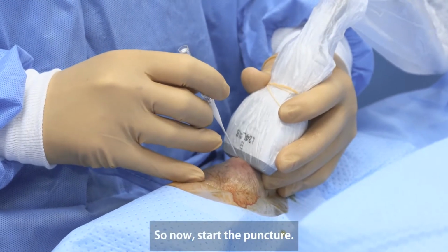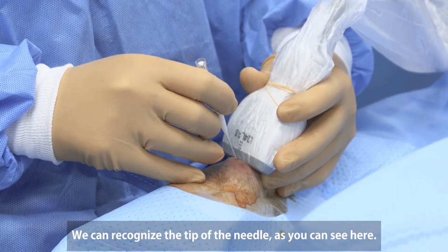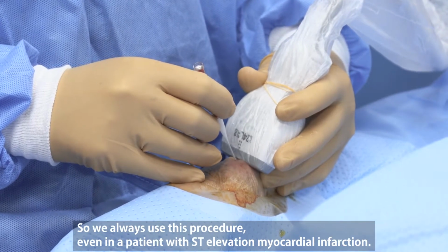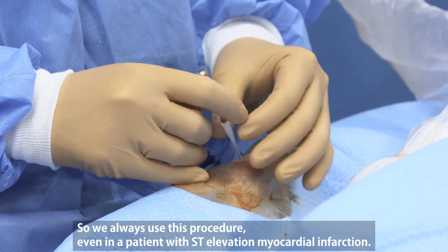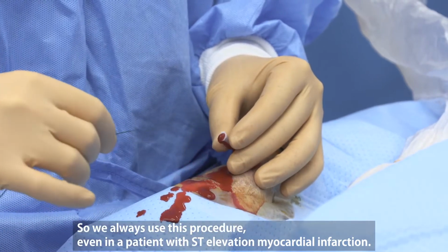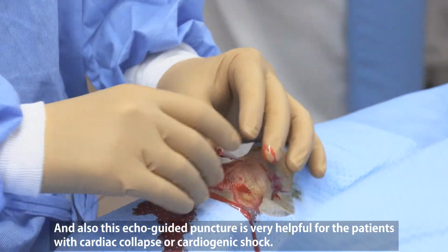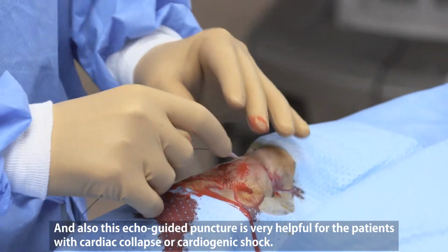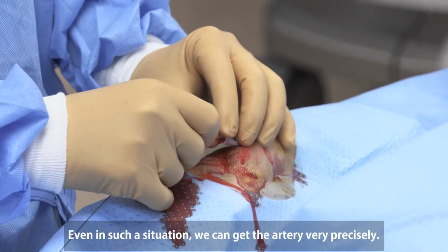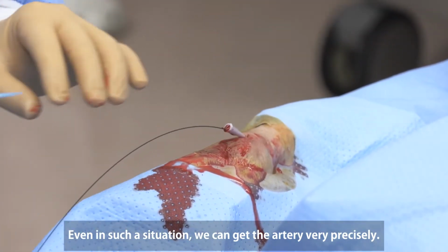So now start the puncture. You can recognize the tip of the needle, as you can see here. So we always use this procedure, even in the patient with ST elevation myocardial infarction. And also this echo-guided puncture is very helpful for the patient with cardiac collapse or cardiogenic shock. Even in such a situation, we can get the artery very precisely.